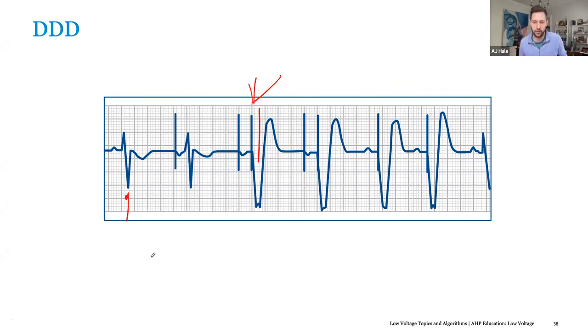Some people I've heard, and once again, you want to read the studies on it yourself, I'm not a doctor, but some electrophysiologists I've worked with will argue that if you're waiting 450 milliseconds, you're doing a disservice to your patient by waiting that long because they're losing that atrial synchrony. They're losing 30% of their output. So you just have to weigh all those factors when you optimize a patient.